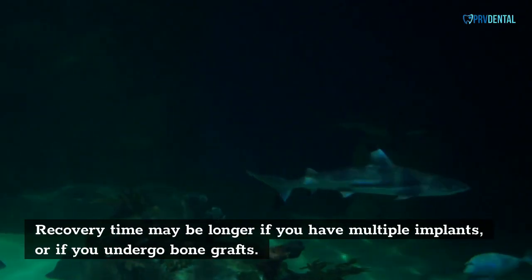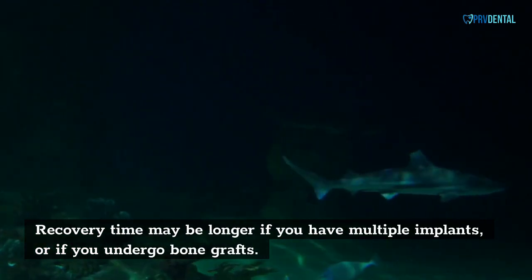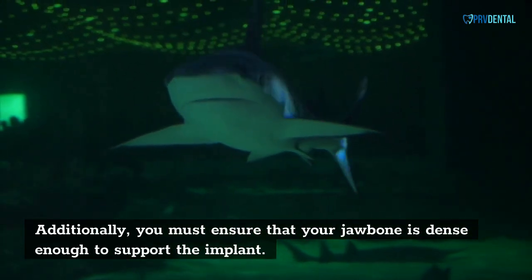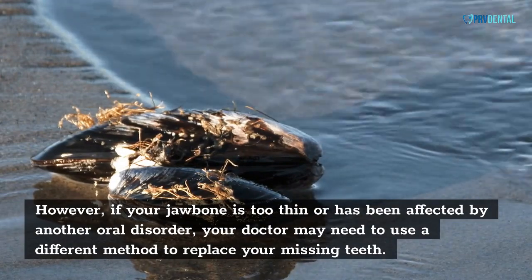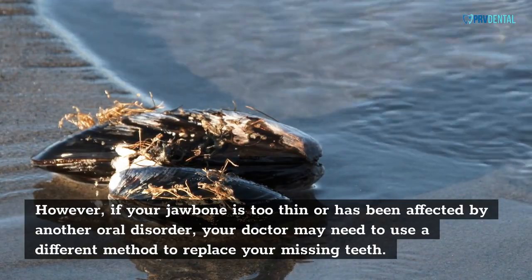Recovery time may be longer if you have multiple implants or if you undergo bone grafts. Additionally, you must ensure that your jawbone is dense enough to support the implant. However, if your jawbone is too thin or has been affected by another oral disorder, your doctor may need to use a different method to replace your missing teeth.